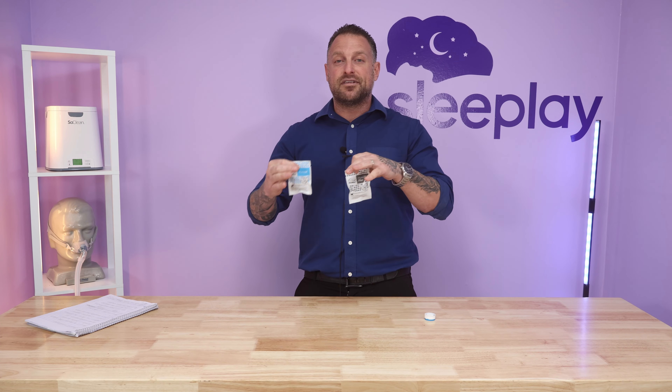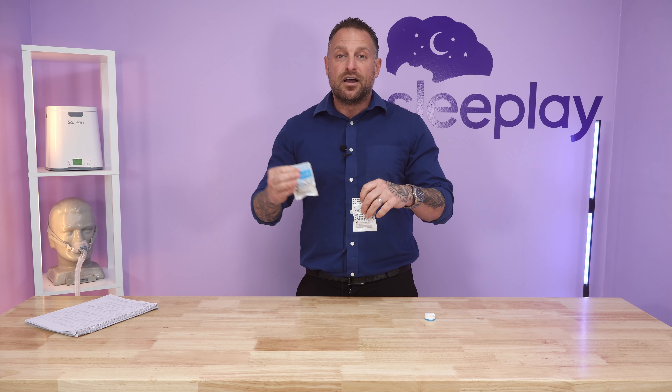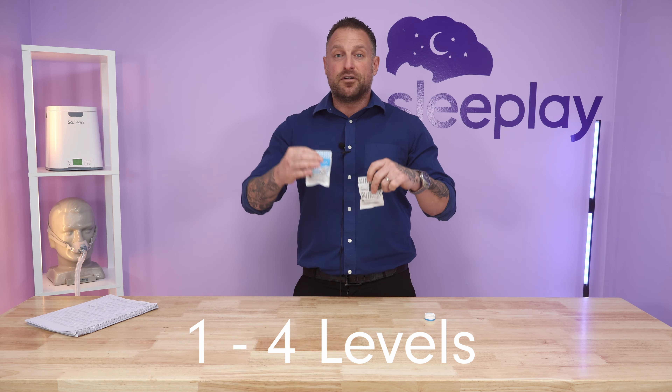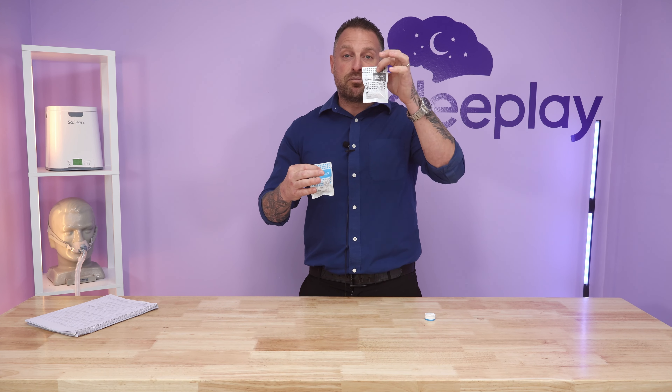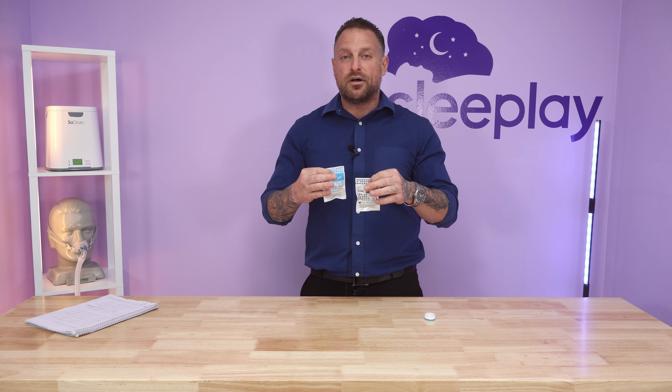I would compare the standard to an AirSense 10 machine — it's more of the one through four humidity levels, just general humidity for your average usage. If you need more humidity for drier climates or higher altitudes, they have the plus as well, which I would compare to about a five through eight level on an AirSense 10.